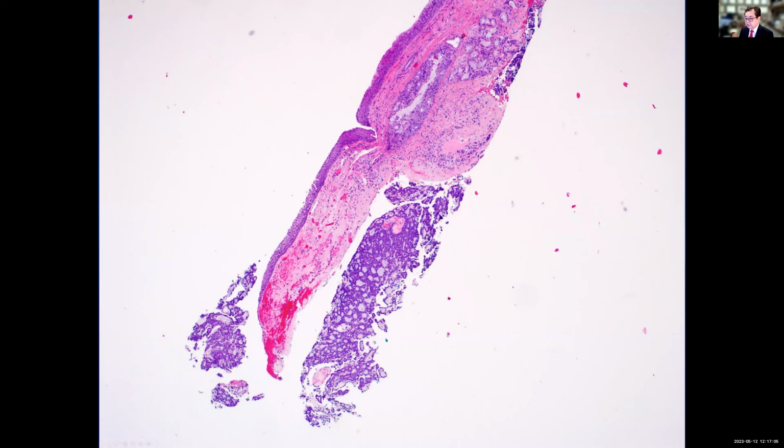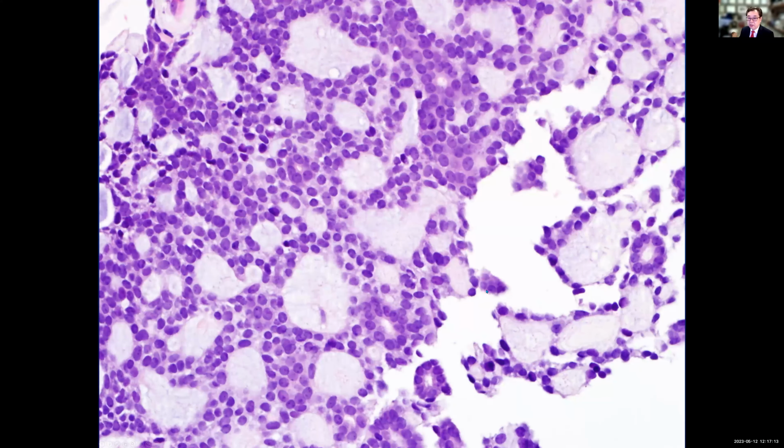That's why I want to be careful. The small biopsy demonstrated the tumor here with a Swiss cheese look to it, and clearly we thought about adenocarcinoma. Look at the mucoepidermoid, the epidermal. The adenoid cystic. This is cystic, right? Adenoid means the gland is open into the stroma here, and it's a very nice demonstration. And occasionally you see a true gland. That's a part of the spectrum.